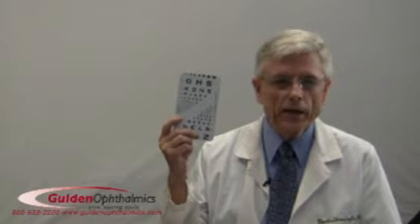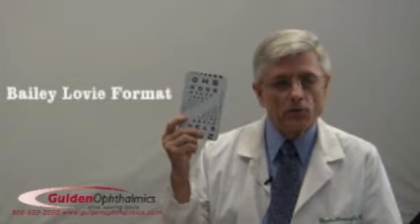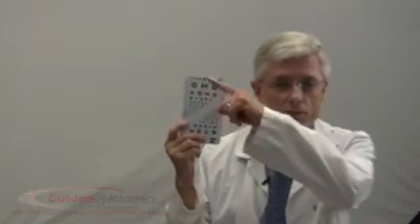Most were not scientifically designed, and many of the letter sizes were not accurate. This card is scientifically designed using the Bailey-Lovie format. Thus, it uses Sloane letters and is a geometric or logarithmic progression of sizes.